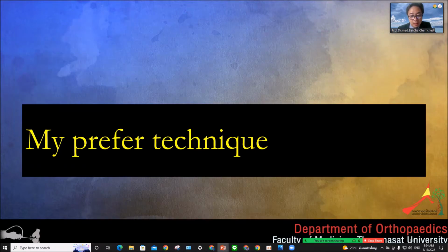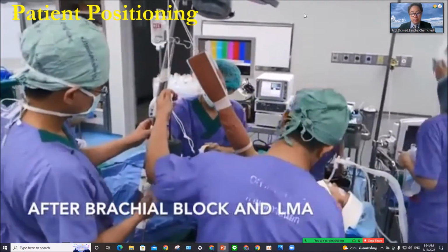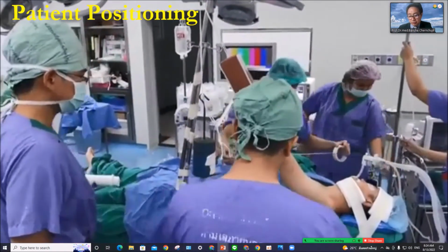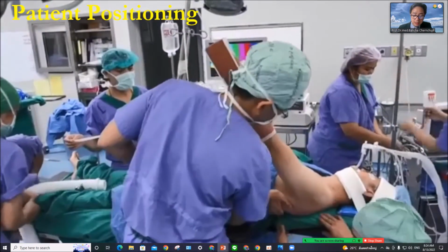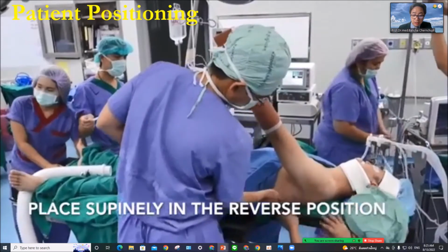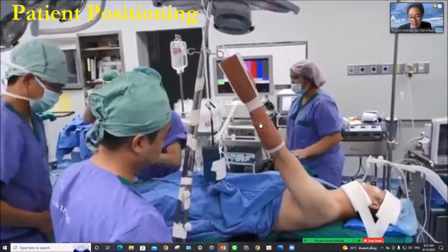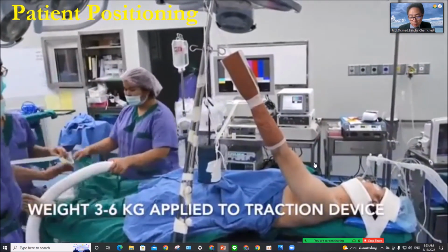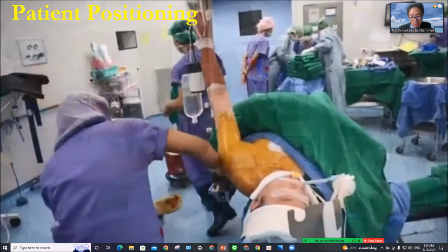So this is my technique. I think patient positioning is important because we need space. I don't use the beach chair position for instability. This is what we propose for arthroscopic technique. We call it the TU supine position. We do simple traction using skin traction and stabilize the head. The weight is about 3 to 6 kilograms.